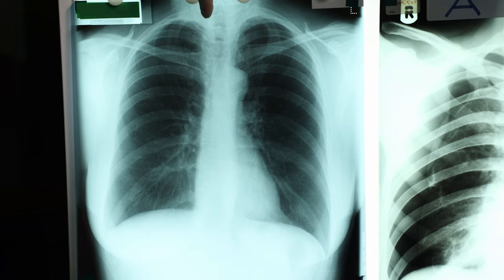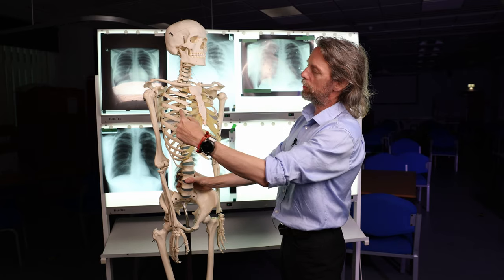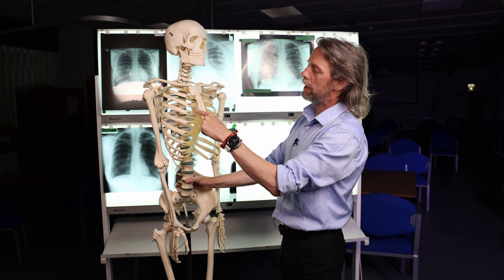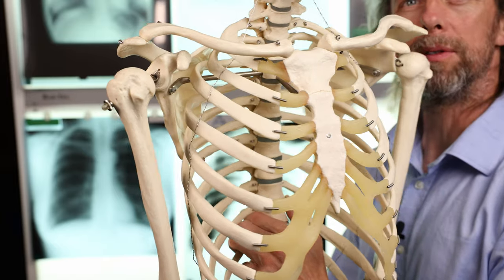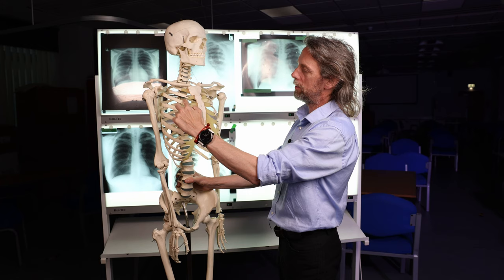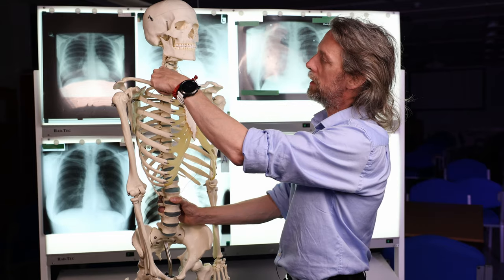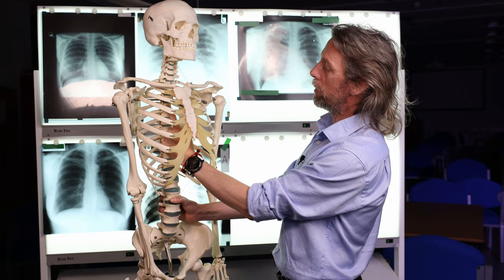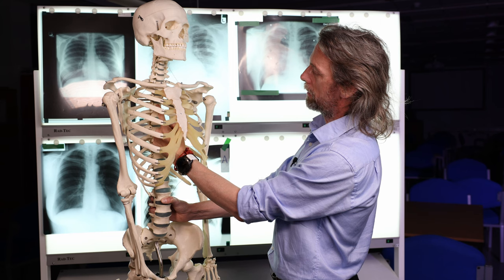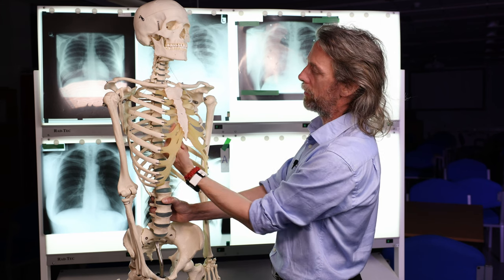That means you can see the ribs as nice and white on the chest x-ray, and also the vertebrae. But remember that the ribs anteriorly become cartilage — there's a cartilaginous section before they meet the sternum — which means that if you try to count the ribs anteriorly, it's really, really difficult. So there are two rules for counting ribs: one, start at the top of the first rib, and two, you can see the vertebrae really nicely on the chest x-ray, so start from the vertebrae at the posterior part of the rib and follow it round.